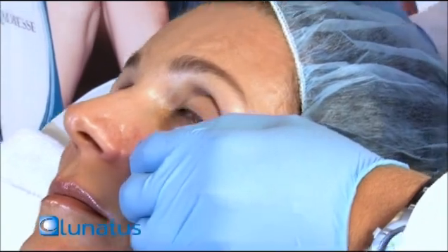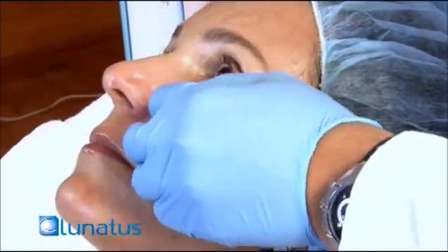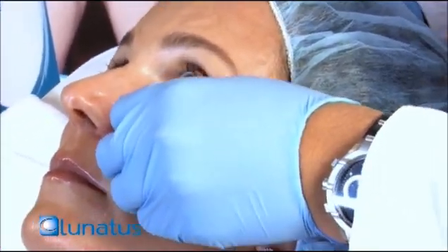I do not inject the tear troughs whatsoever. You also should not inject the tear troughs. What happens basically is the area can calcify and can be problematic.